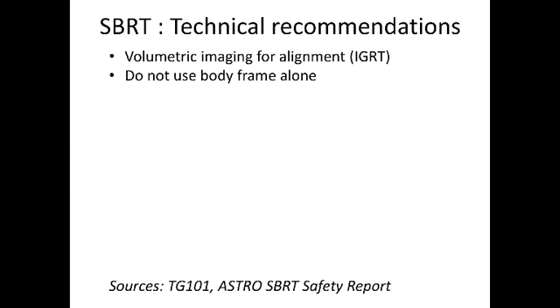All right, now we come to the technical recommendations around SBRT and how to do it safely, and I'm drawing from a couple of different reports here. The Task Group 101 report from AAPM is a definitive resource on this topic. First of all, you need volumetric imaging for alignment. The reports say this now, and you should not use the body frame alone to accomplish SBRT.